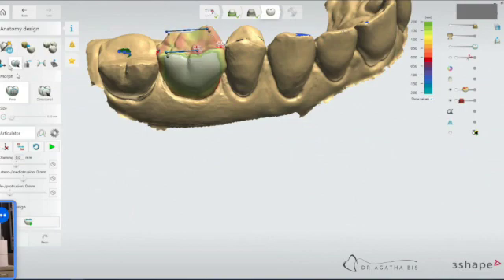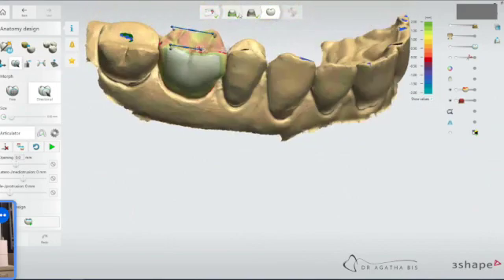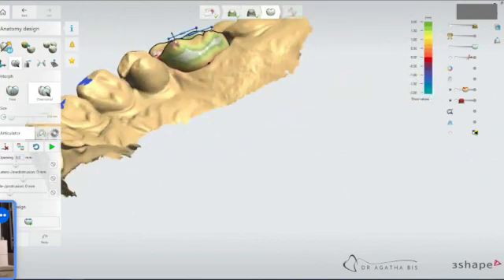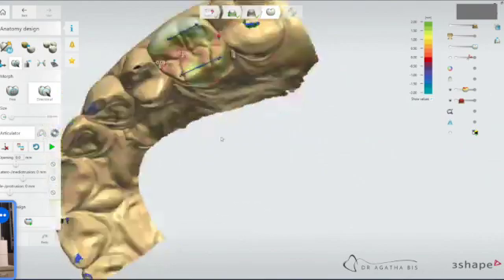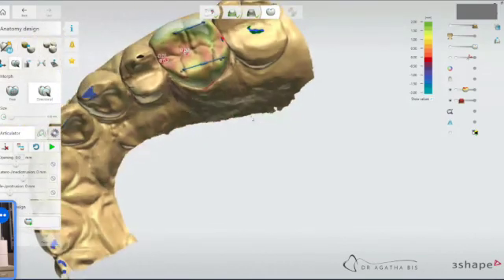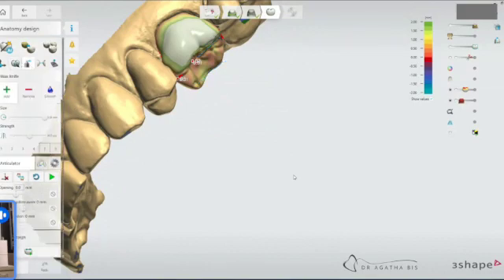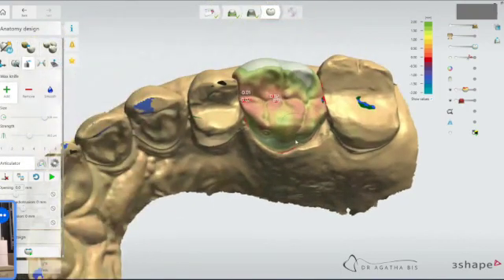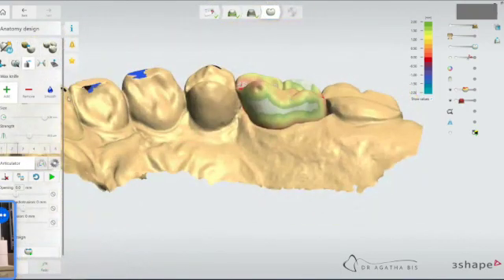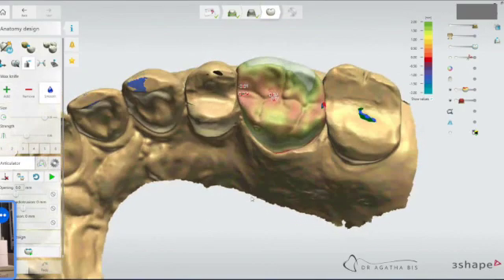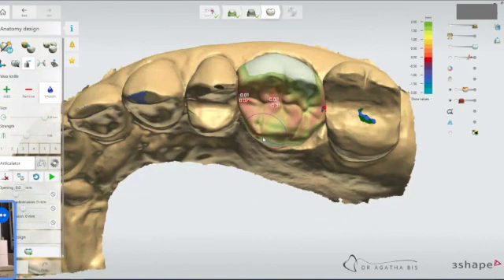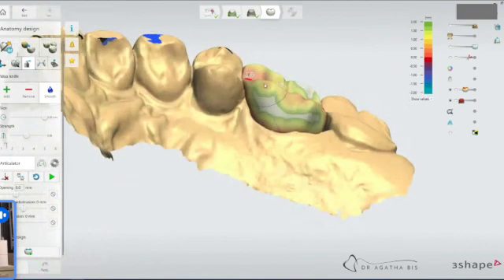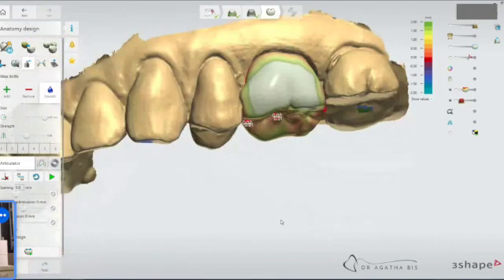So let's bring it down a bit. I really like the wax knife. This is my favorite tool. So what I'll do in this case is smooth it out. We'll go to smoothing tool, middle strength and I can just clean it up a bit. And now it's looking a little bit better. You can bring it down a bit more. Still kind of clean.